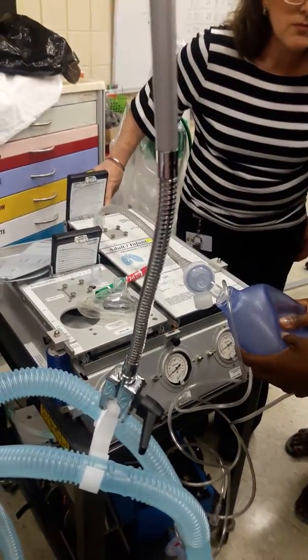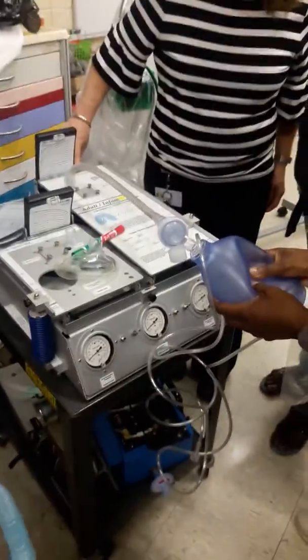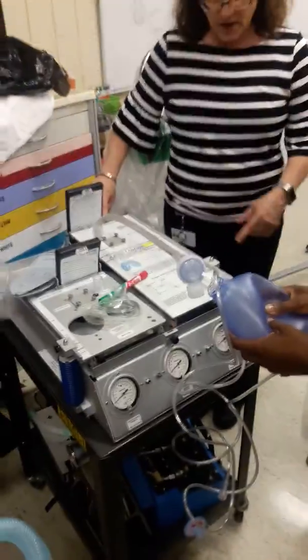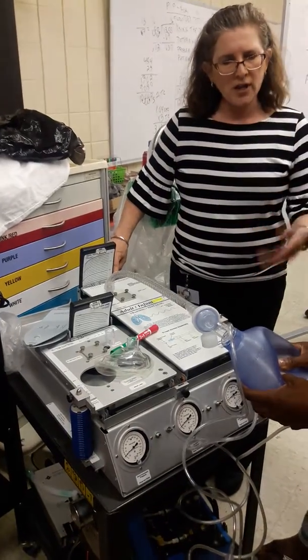That's your plateau pressure. Holding the breath, 0.5 is here. So your plateau is 5, with a compliance of 100 milliliters per centimeter of water. Okay? So go ahead and let go.